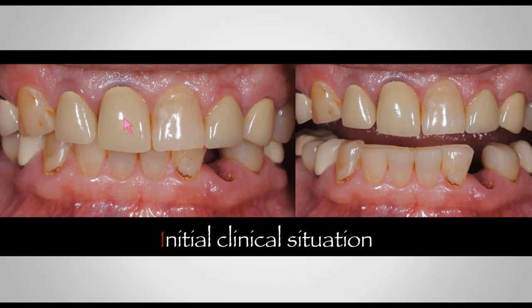So here I'm going to remove a little bit of the glaze by etching these PFM crowns with hydrofluoric acid for 60 to 90 seconds, and then remove that, place my silane, put my adhesive, and then do a totally separate bonding procedure for my natural teeth. I had 1 and 2 natural teeth here, and I had 4 crowns.